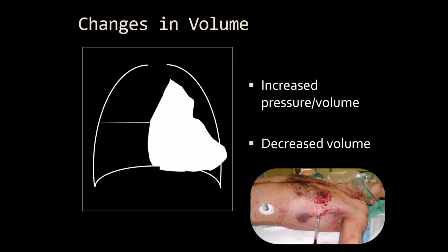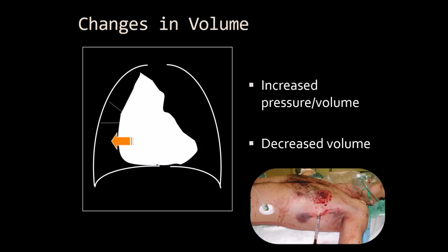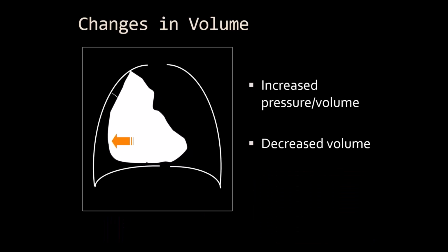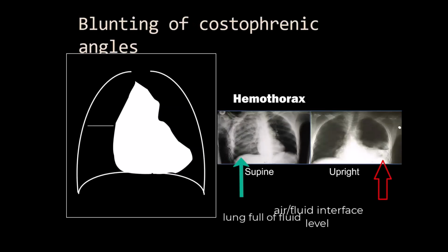By putting a chest tube in and releasing the air from the lung, the pressure is released and the lungs return back to normal. We can see if the organs were shifted to the right, we would have had a left-sided pneumothorax.